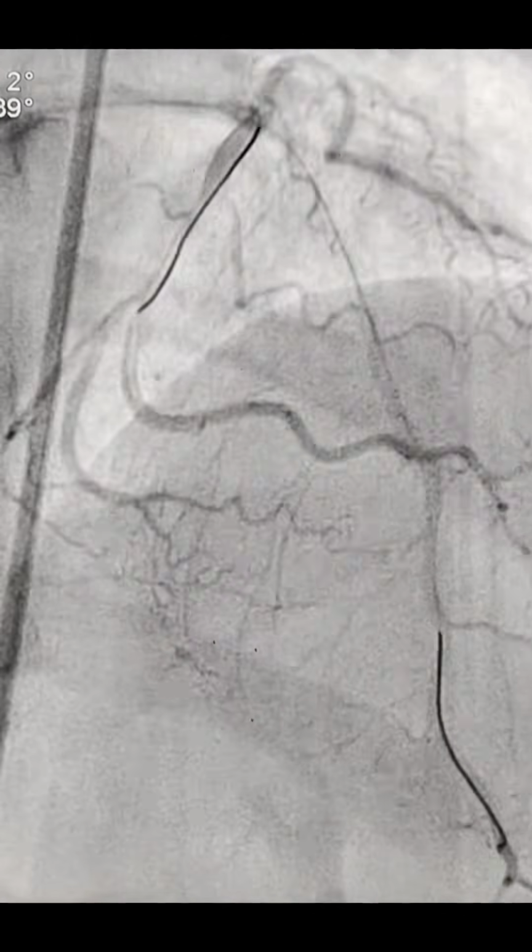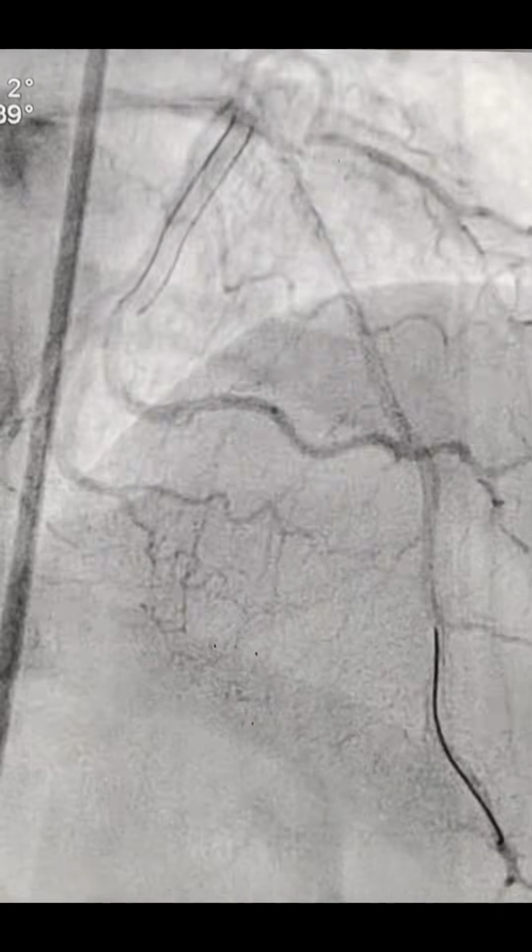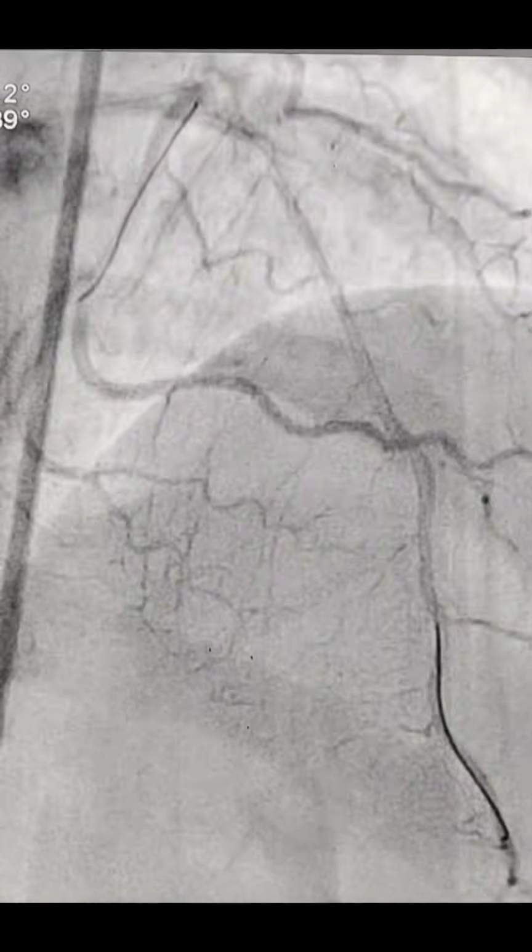We have given the NTG and all, and then gently we pulled out this wire and catheter, and somehow we got it out.